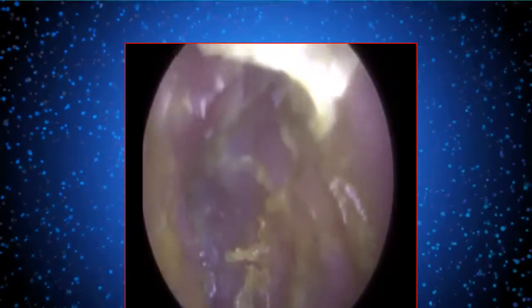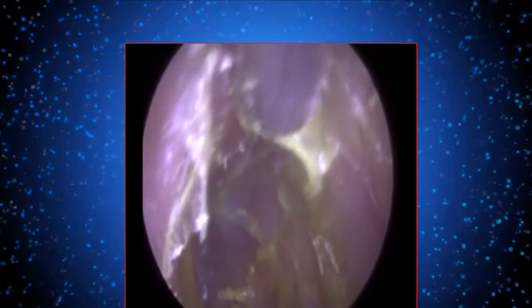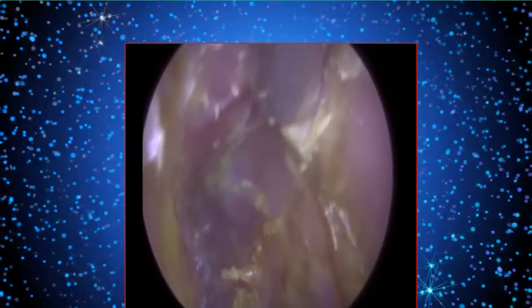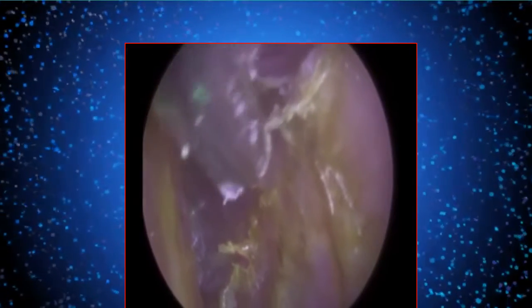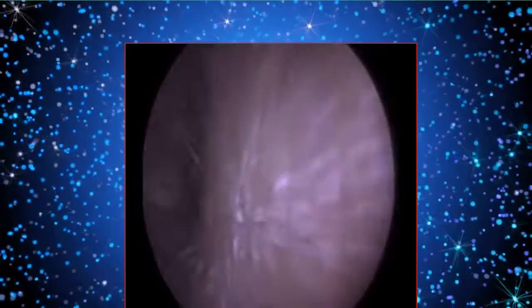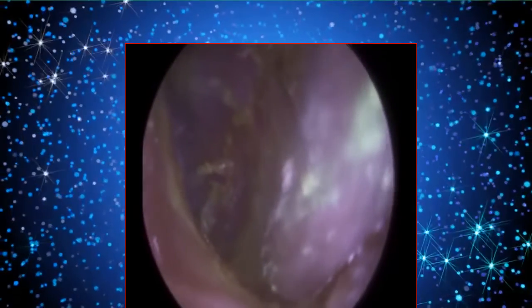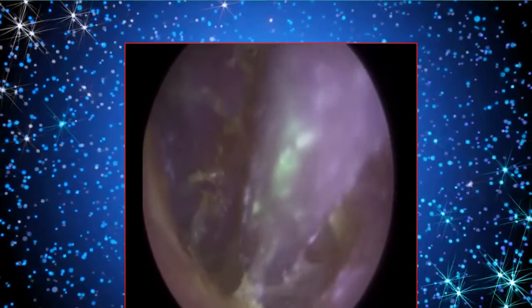So we can see the anterior portion of the eardrum, the front part. There's still a bit of debris around the edge. Continuing with the procedure, it wasn't necessary to improve the patient's hearing. I think the hearing at this stage, and when I complete the procedure, wasn't much different. When you've got an infection like this, you try to get as much debris out as possible. I'm not encouraging someone to get all of it out, just as much as you can, as safely as possible, because we don't want to clear this debris out and then cause a perforated eardrum. You're in search of curing one pathology issue, and you create another by trying to cure the first. That's where a good practitioner knows when to stop as well.